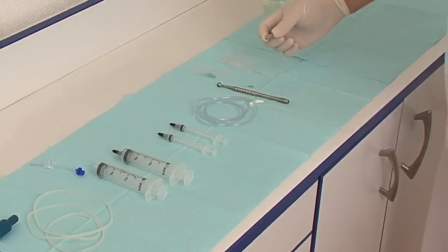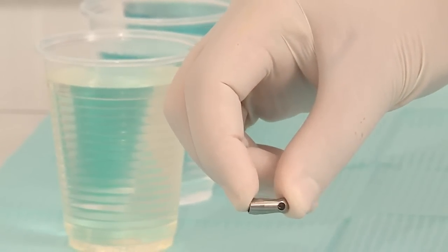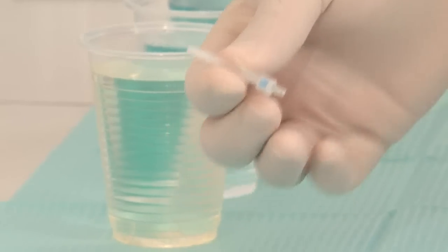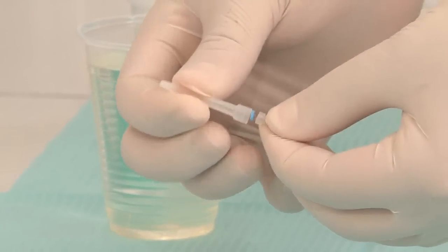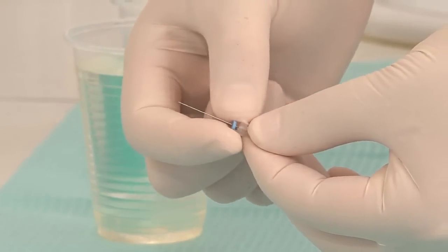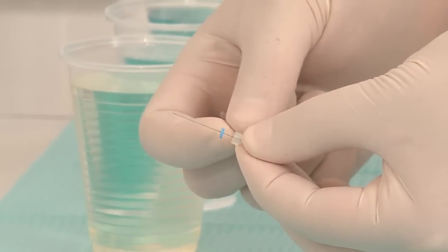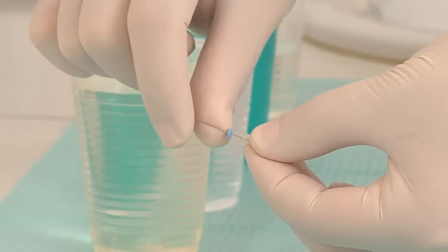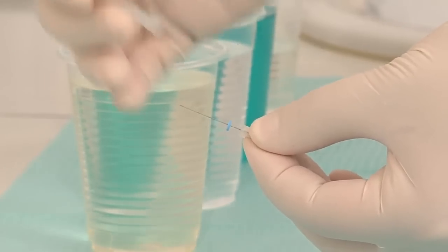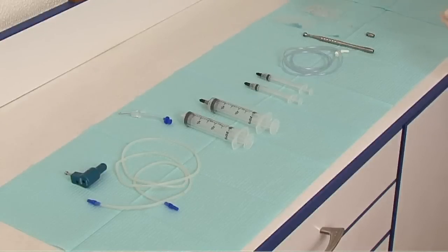And this is the adapter of the micro cannula that's going to create this negative pressure in the apical area. The micro cannula that we see here comes in three different lengths with a rubber stop already inserted that we are going to adapt according to your working lengths. It contains three small laser holes. It's flexible, so it will go with the curvature of your canal. We need to adapt it to the exact working length of the root canal.